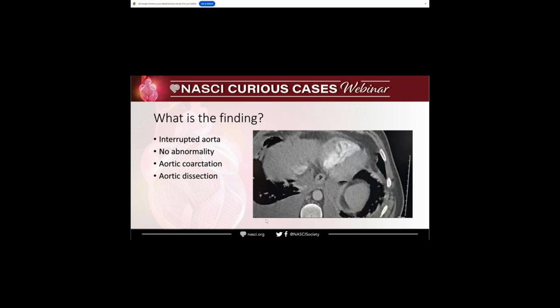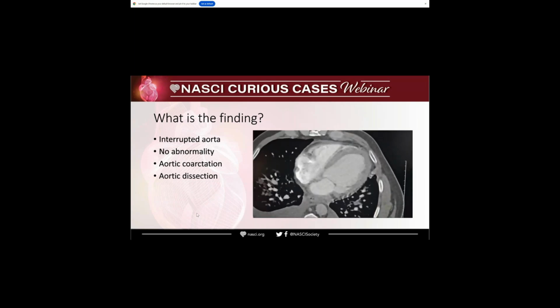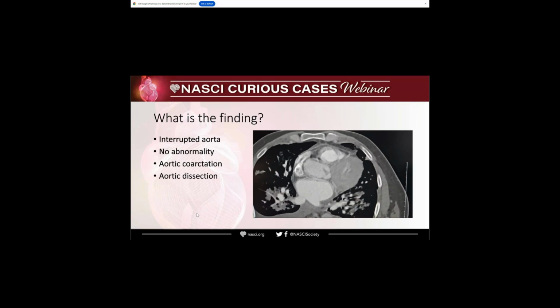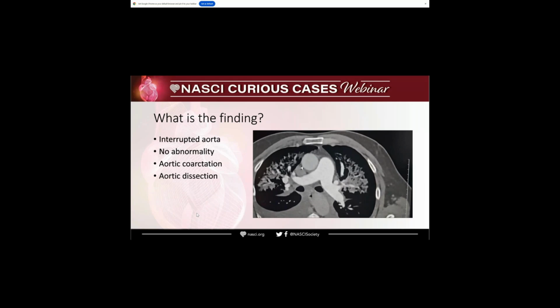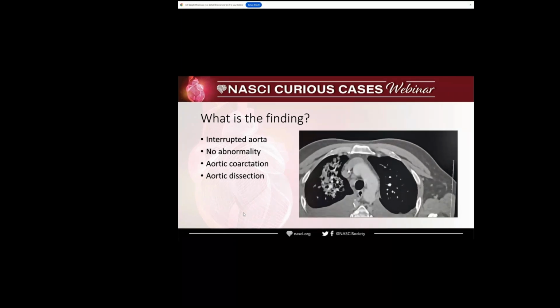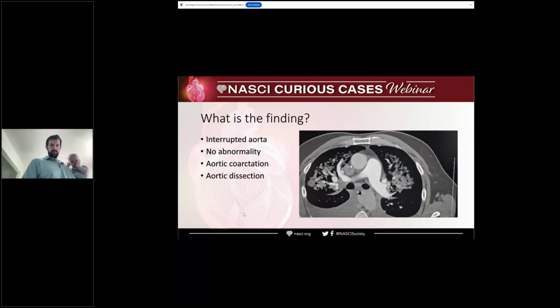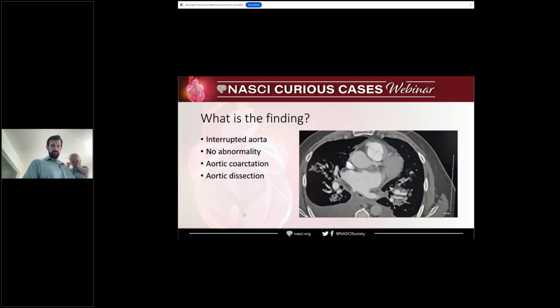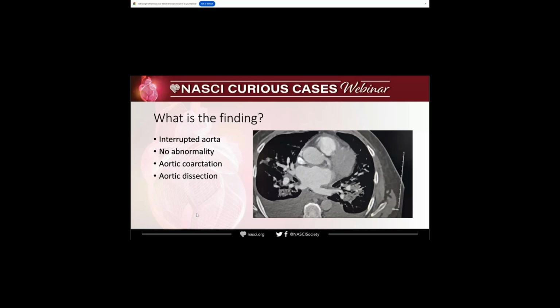I'm showing you the video again so you can notice it. Anybody have an idea? Is it an aortic coarctation? Yeah, it is.